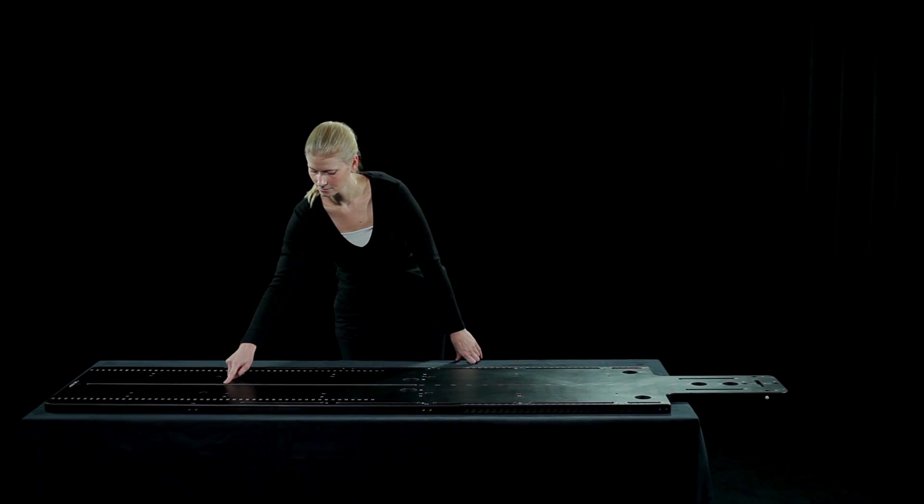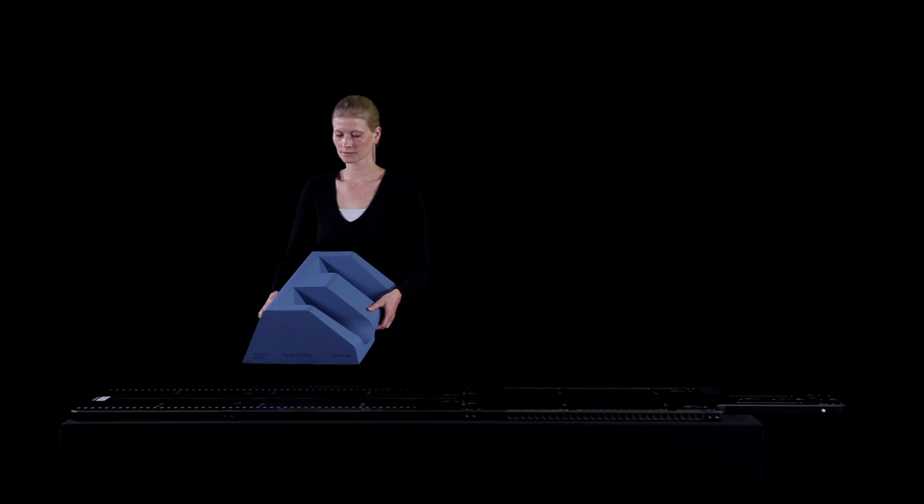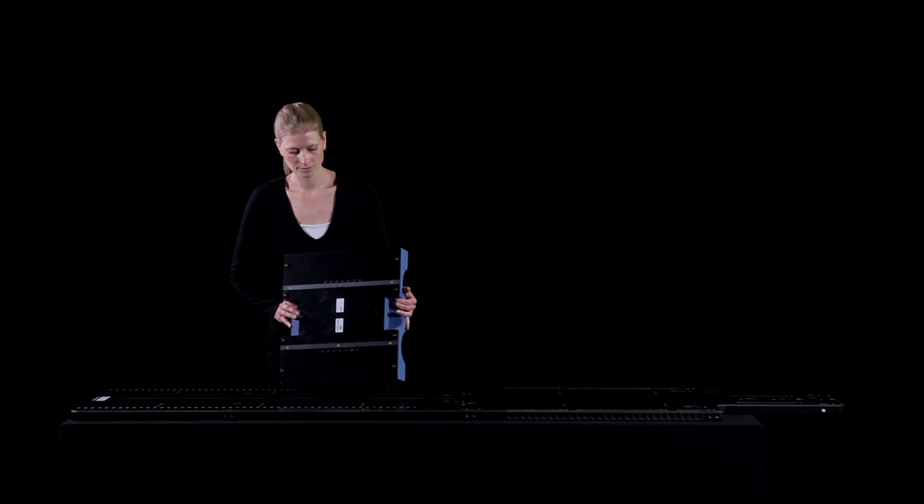Different sizes and shapes of thermoplastic masks are available, such as a head and neck, a pelvic, a thorax and a knee mask. Two separate cushions to immobilize the knees and the feet can be indexed to the SBRT baseplate.